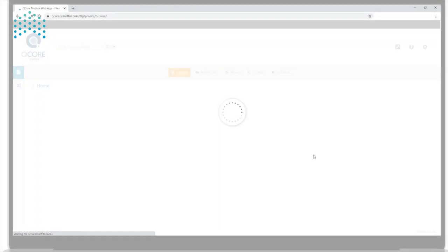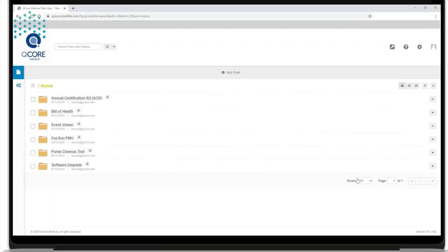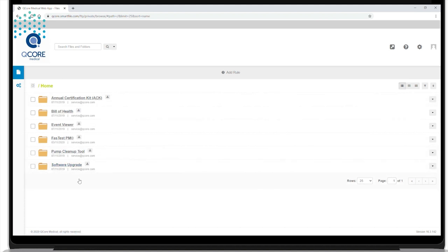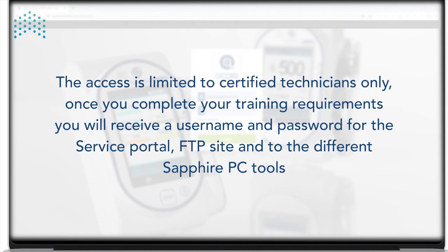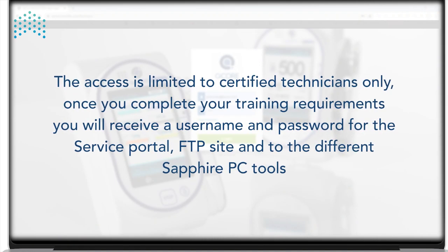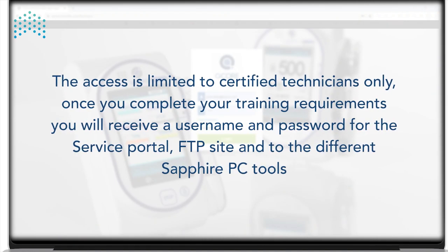The first step is to install the software on your computer. The software is available for you to download along with all other Sapphire PC tools on the FTP site. Access is limited to certified technicians only.